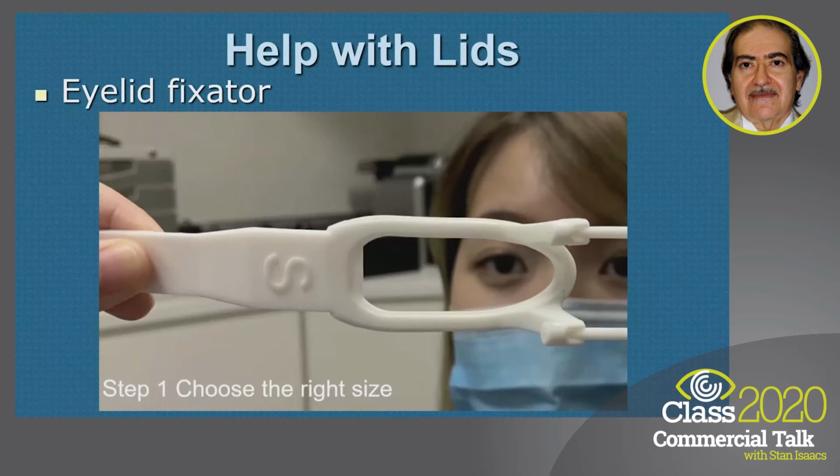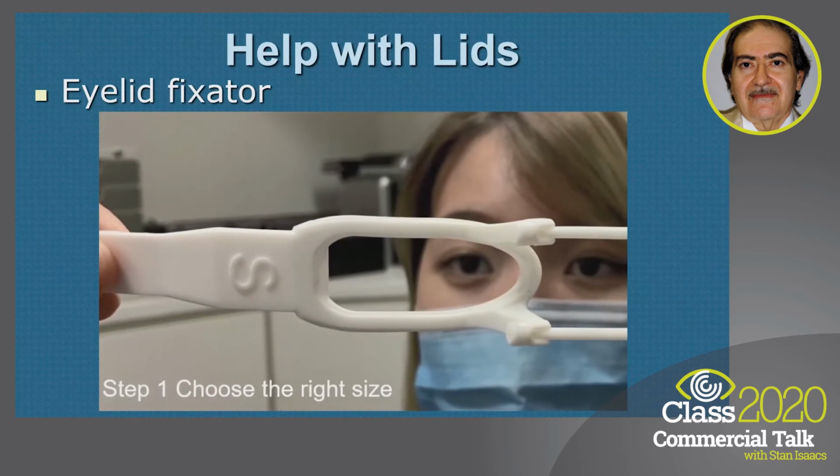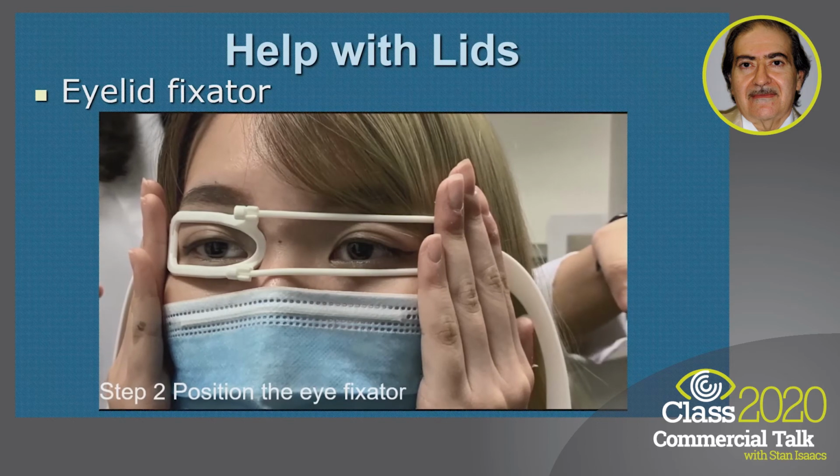Now, this is what they call an eyelid fixator, which is actually a direct translation from Japanese. Whether I translated it correctly or not, I don't really know. Let me just show you how you put this on. It's actually made of silicone, and you just put it on the eye.